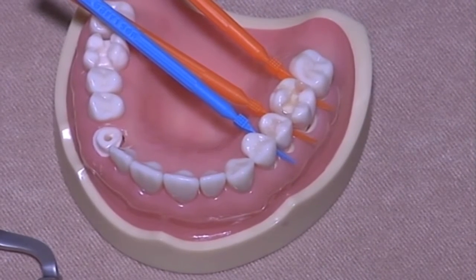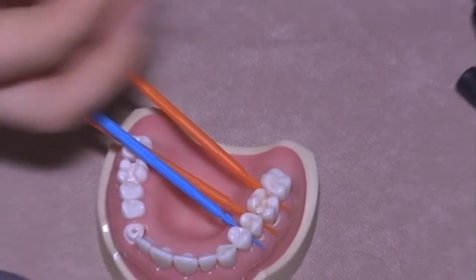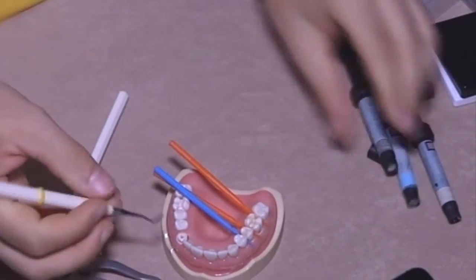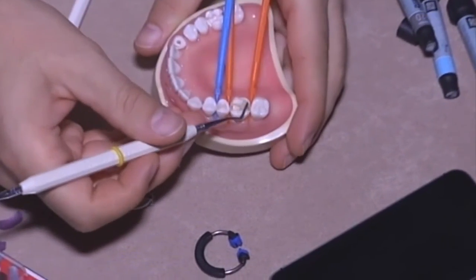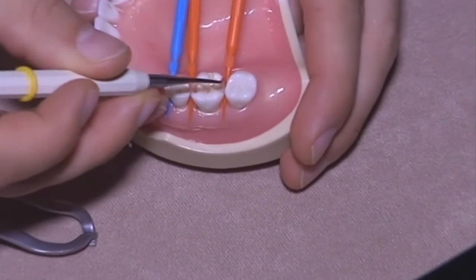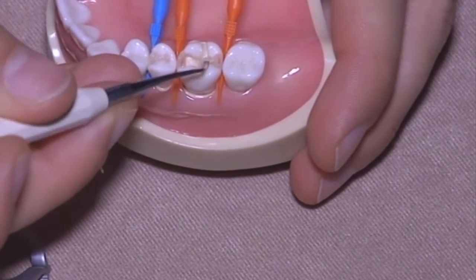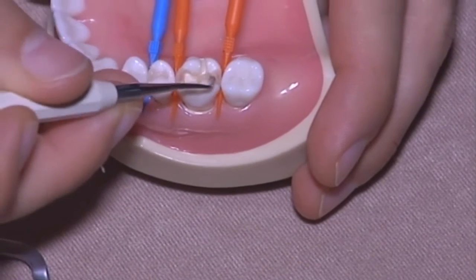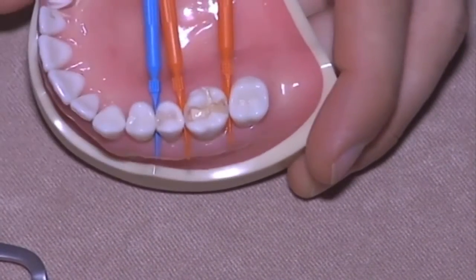Let's do the layering of the second class cavity on the molar. Dentin shade. Here, because the cavity is bigger, I proceed cusp by cusp, even with the dentin and even with the enamel.